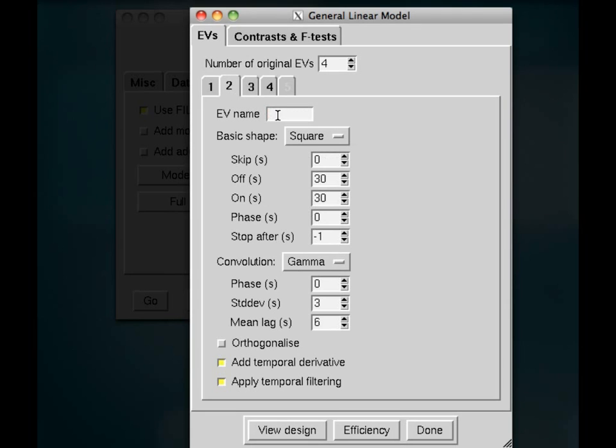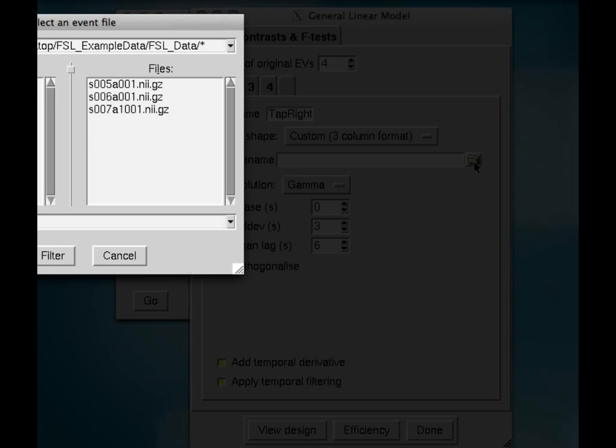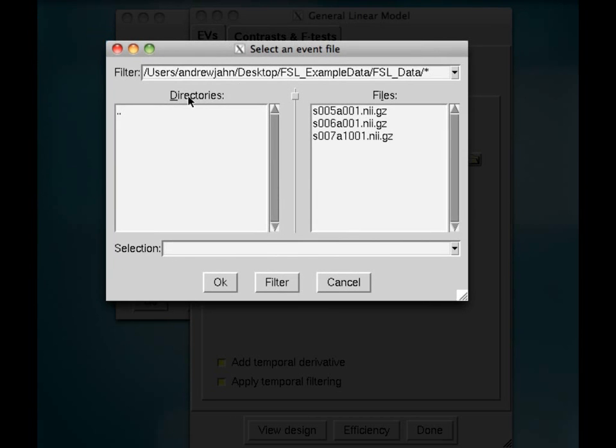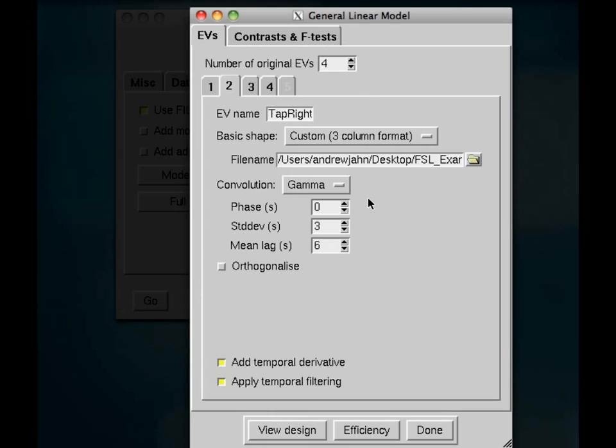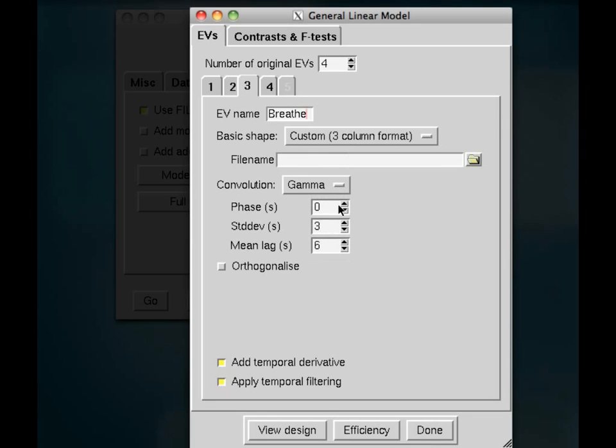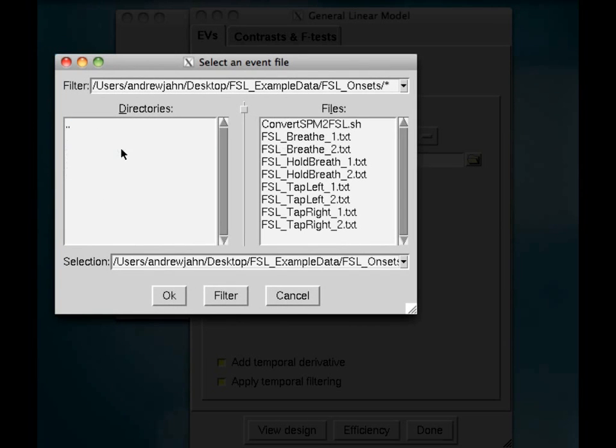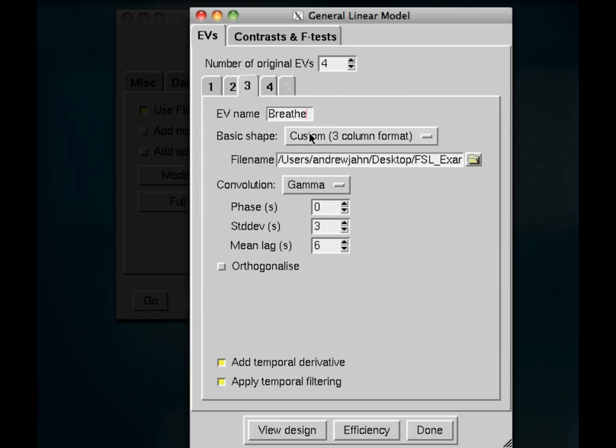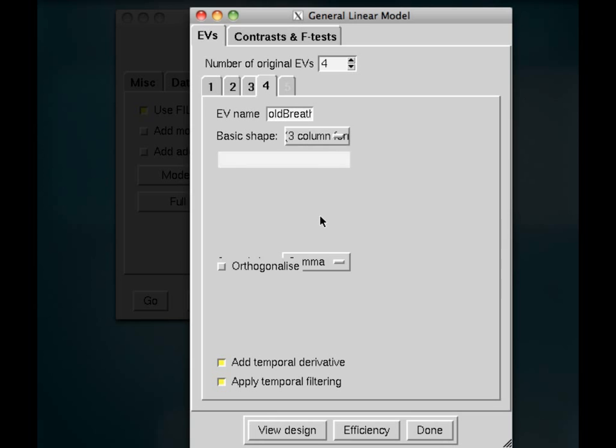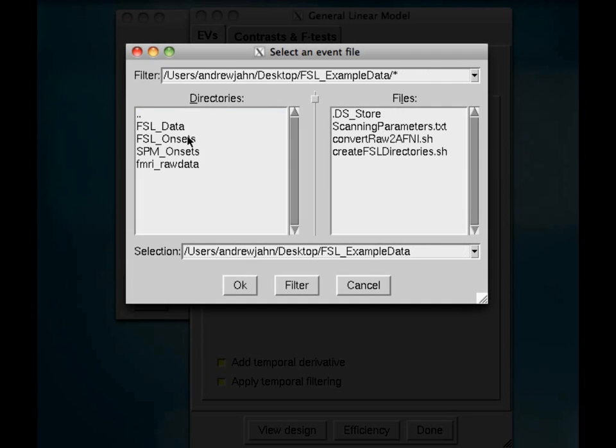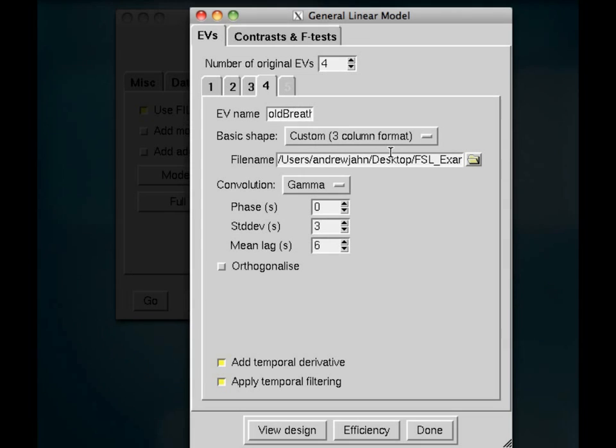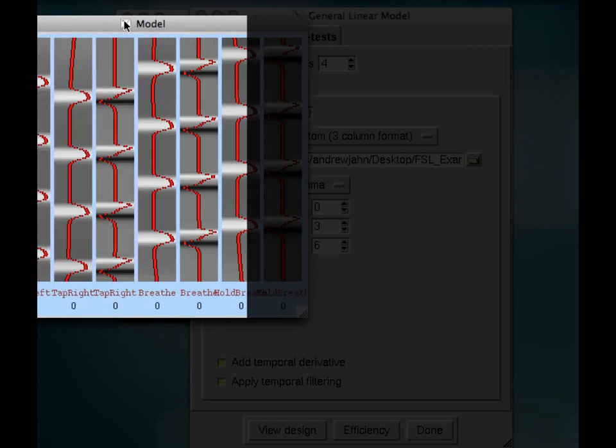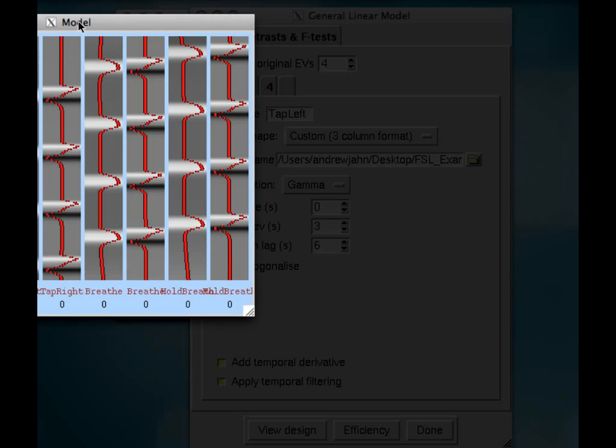So I'm going to go ahead and do the exact same thing for the other regressors. So just follow along. And it should just be a few seconds. Again, I'm going into FSL onsets. I'm selecting each condition with the underscore one in front of it because we're dealing with run one.